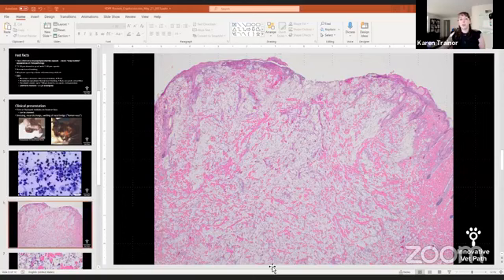And so I'll just show you a couple more examples. We'll go to a PAS stain from this case. Now, this is a PAS with a green counterstain, and I really like this for derm path. I think it shows things beautifully, and it's really nice to see the narrow base budding. So it highlights the organisms beautifully. With the PAS and the GMS, you're actually staining the yeast themselves. And I'll show you another stain that will actually stain the capsule.